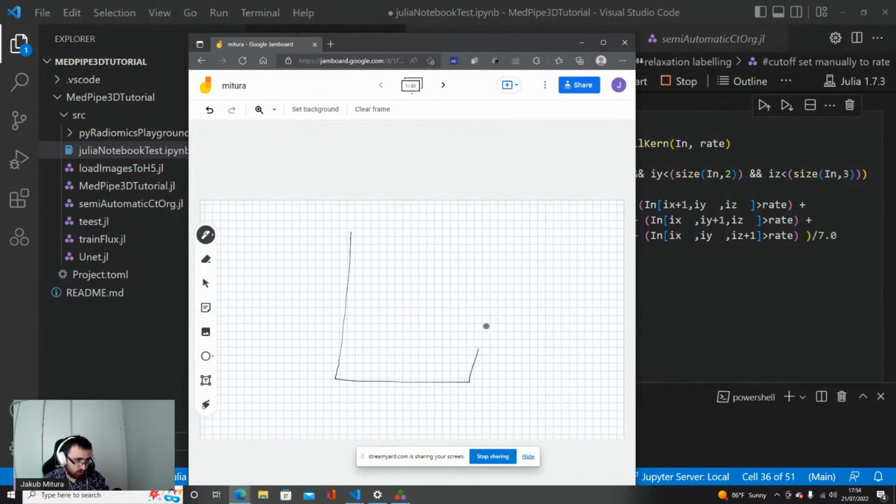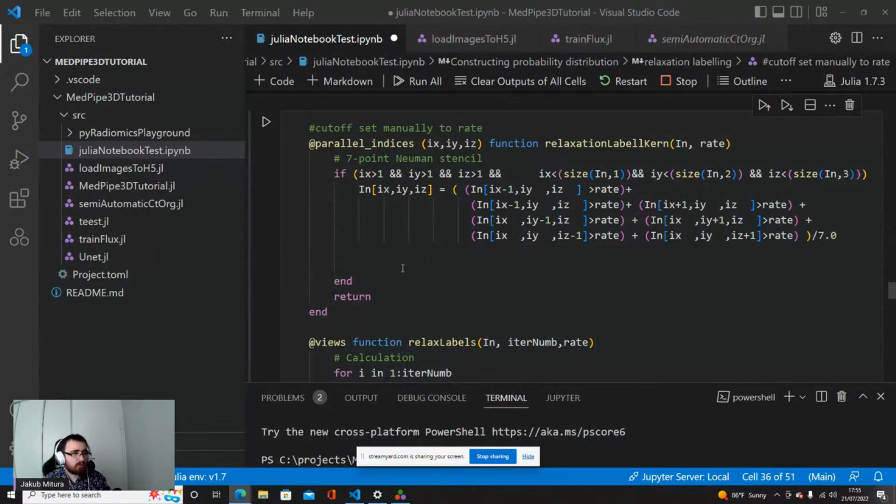So what is the stencil operation? Just for everybody to know, this is something that we already did. We have some point, and all the operation is based on the data from around. We get the data up, down, left, right, in some neighborhood of this point, and we execute the function on each point based on the information of the neighborhood. How does it look?